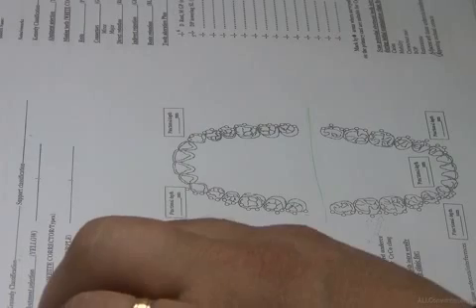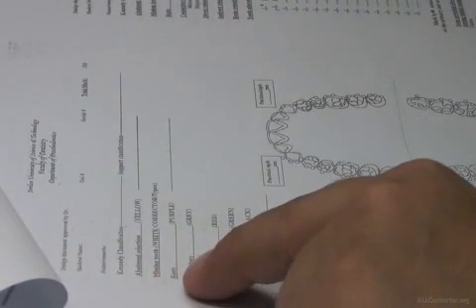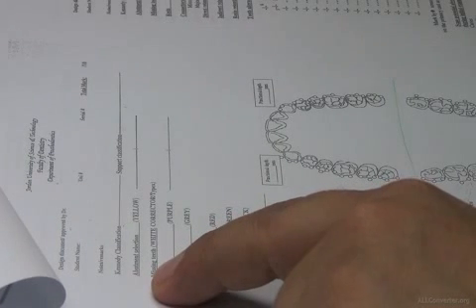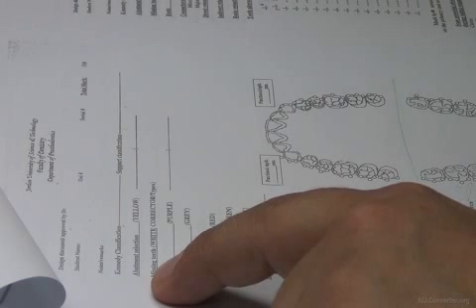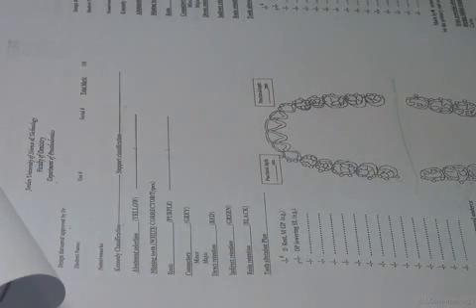Missing teeth, we're going to wipe them away with the corrector. Teeth intended for extraction, we leave them. We don't draw on them, but we leave them on the page to note for the technician that there is a tooth here, so you are not confused, even if it's planned for extraction.